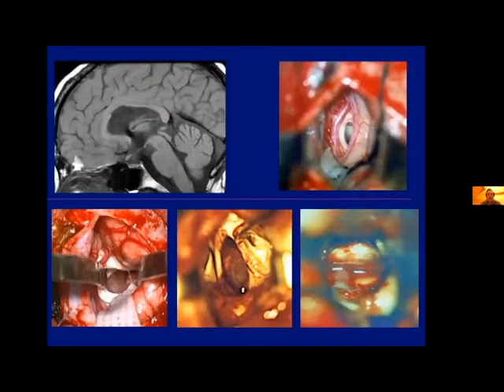Let us look once more at the sagittal view. This is the axis of the transcallosal approach, which goes through several levels. The first level is the corpus callosum. The next level is the foramen Monro. The deeper level is the possible hole in the third ventricle floor if the extraventricular tumor destroys it. If we plan gross total removal, at the end of the surgery we shall see the basilar artery. All of these structures lie on the same axis.